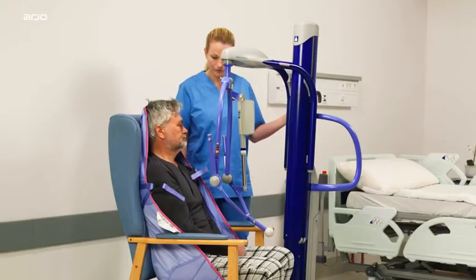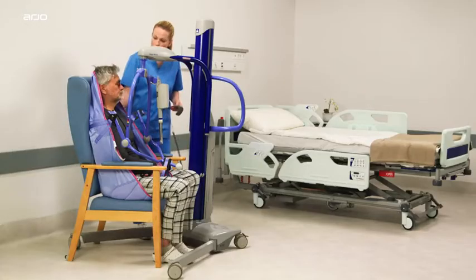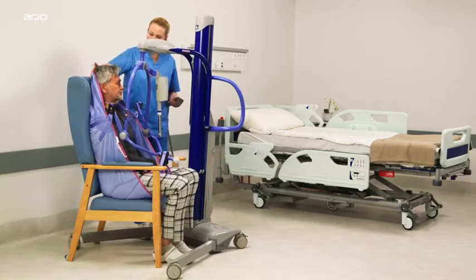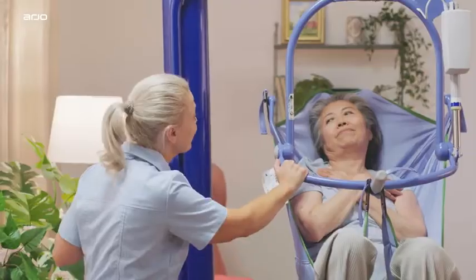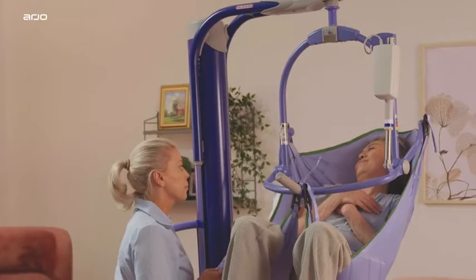The purpose of this demonstration video is to highlight the main features of Arjo's MaxiMove passive lift. Our premium floor lift enables a single caregiver to manage demanding everyday patient and resident transfer and repositioning tasks.